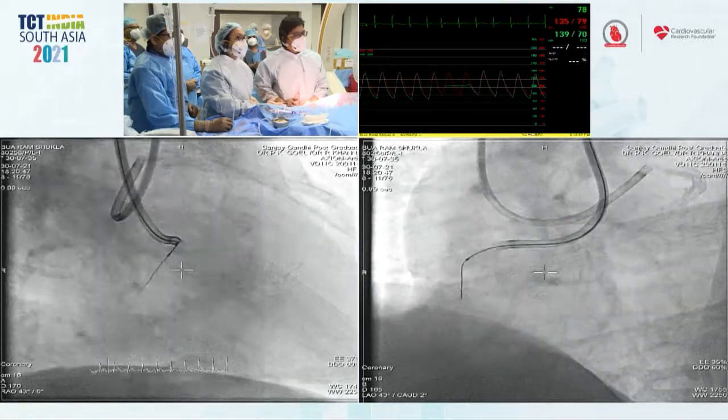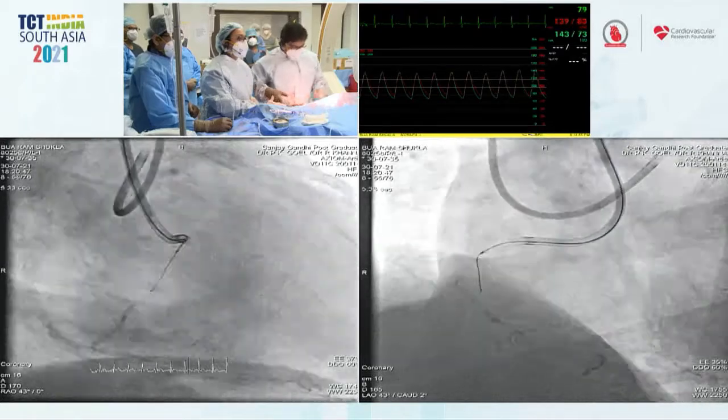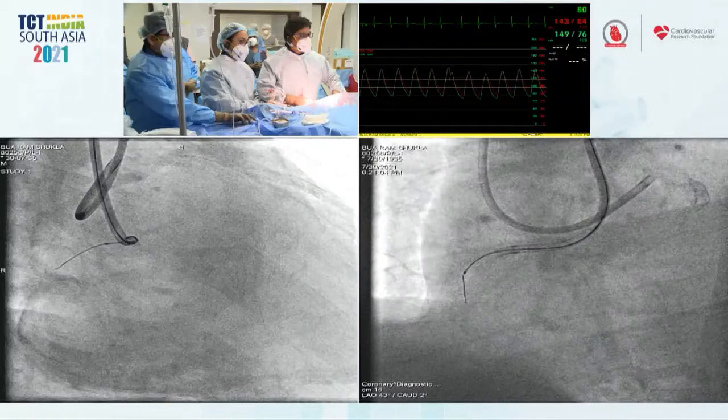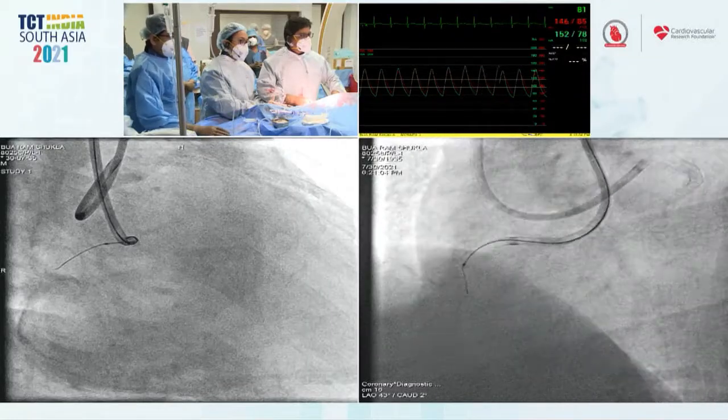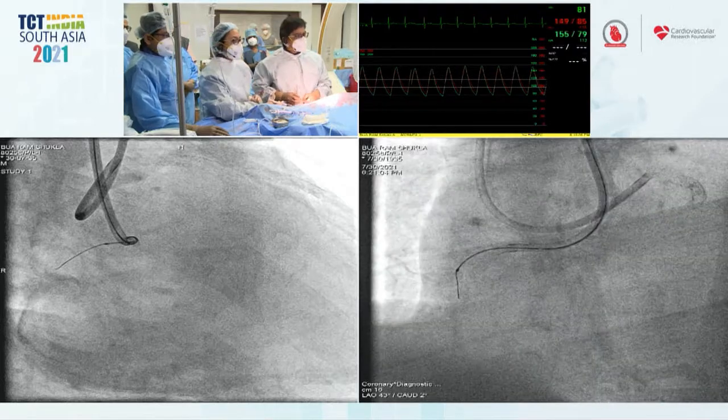I agree with you, Kevin. Typically, I reserve an XTA for when I actually see a small microchannel visually. If I can see a channel, I think it'll probably sneak into that channel. But if I can't, and it's an occlusion, I like something with a little bit more gram weight.